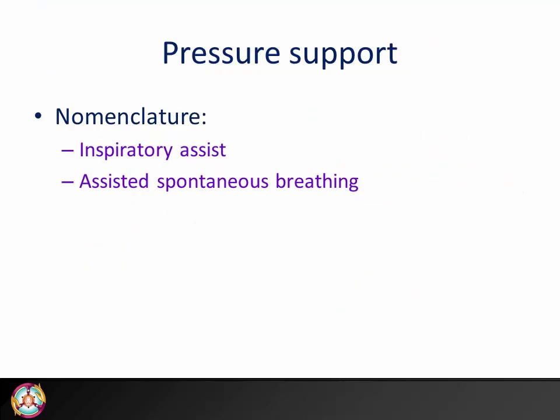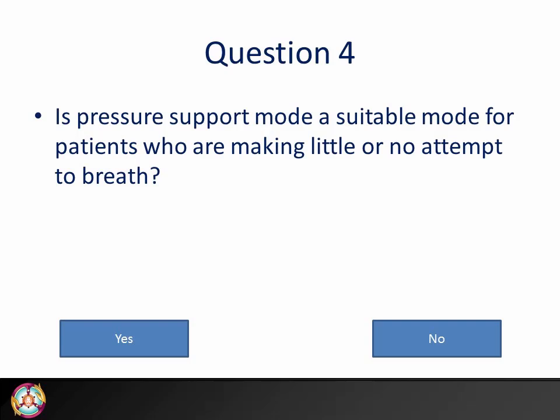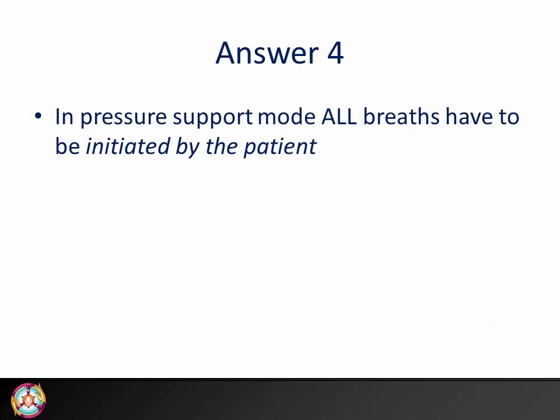Pressure support. This is also referred to as inspiratory assist or assisted spontaneous breathing. Is pressure support a suitable mode for patients who are making little or no attempt to breathe? In pressure support mode, all breaths have to be initiated by the patient, so it's only suitable for patients who are making sufficient respiratory efforts.